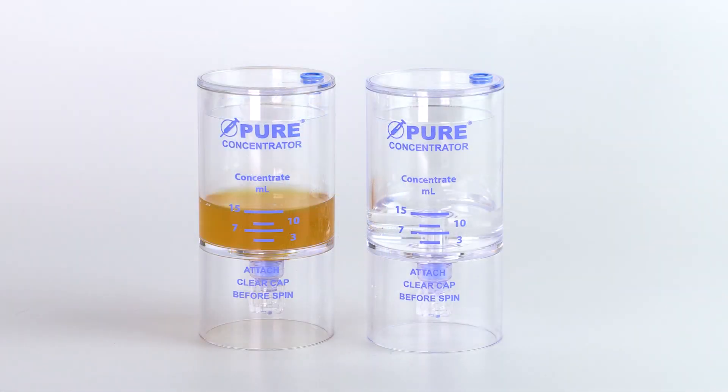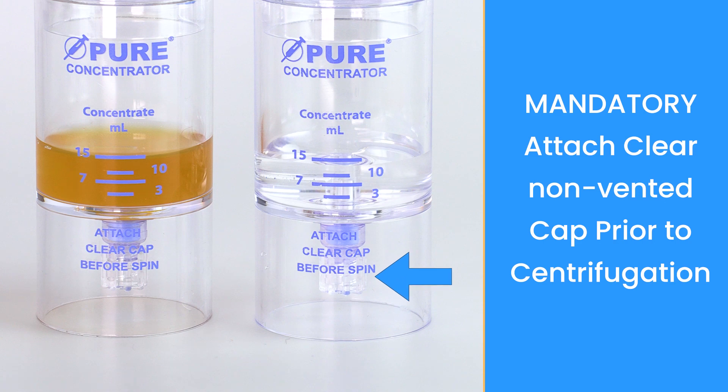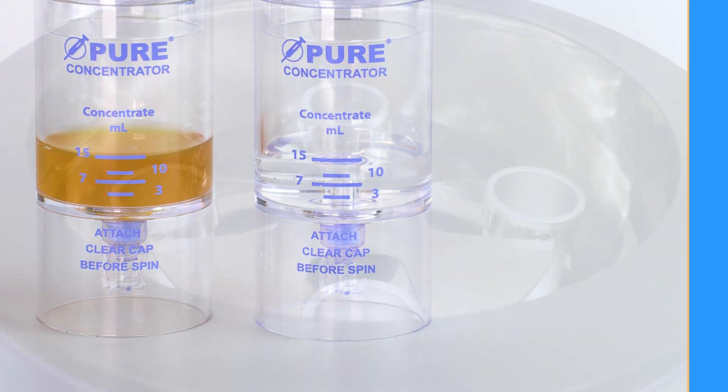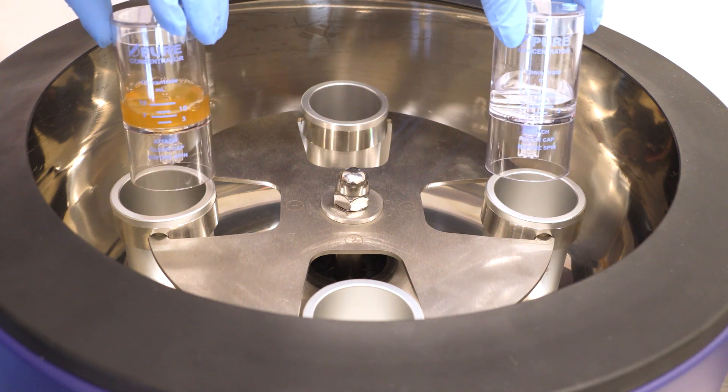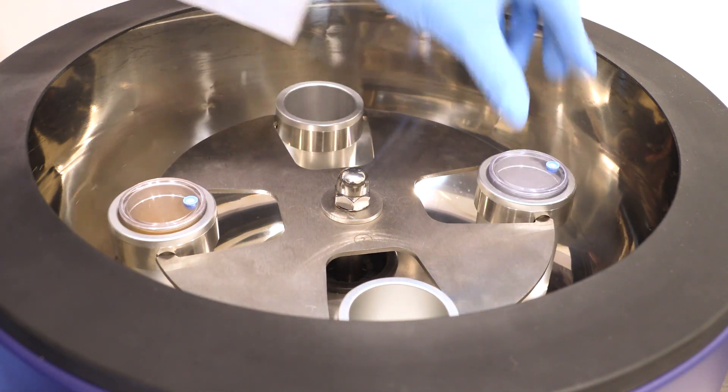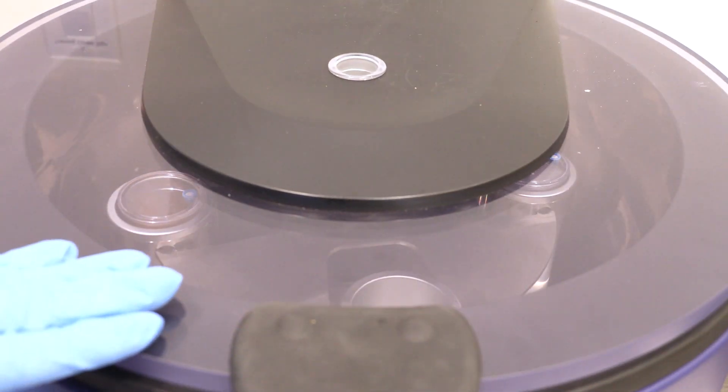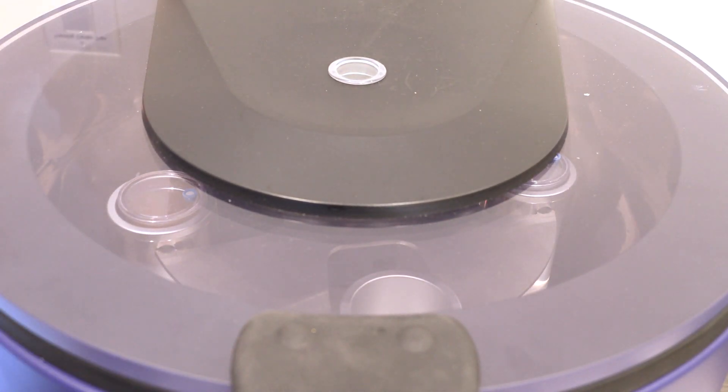Counterbalance with equal volume. Be sure to place the clear non-vented cap to the bottom port of the counterbalance device as well. And place back into the centrifuge rotor at opposite ends. Follow the protocol settings provided in the Pure 2 IFU insert. Close the centrifuge lid and press start.